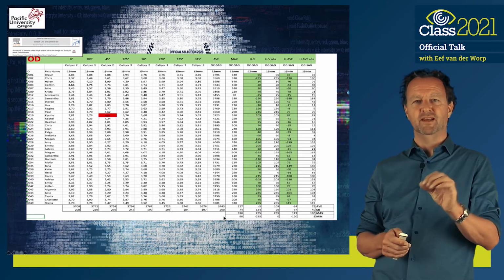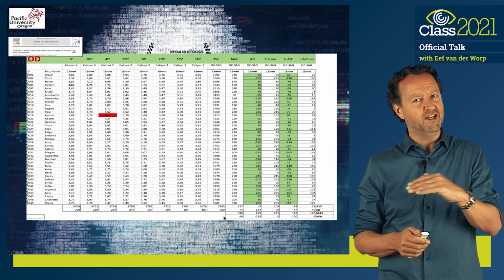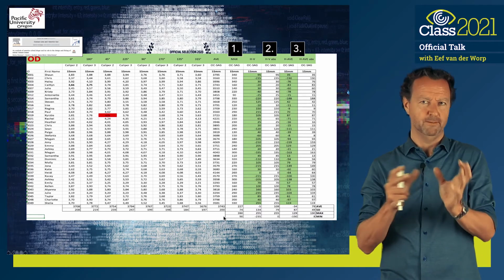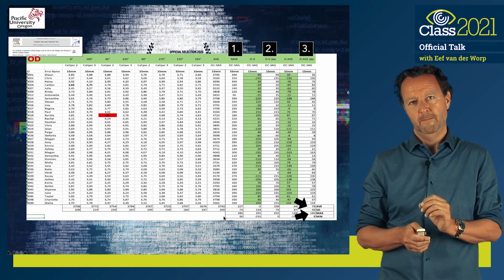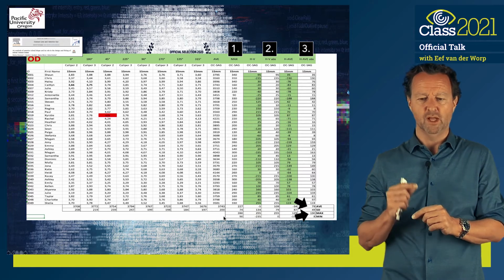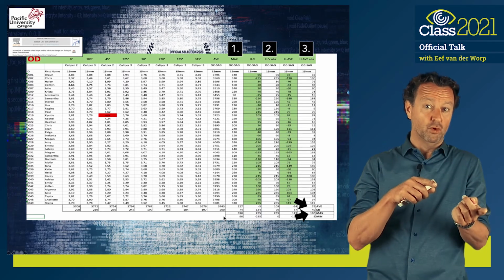But the trick is, as Alessandra told me, of course, she's right, you have to look at individual eyes and not at the averages. So let's try to do that, and I'll take a shortcut for you. I'll make it a little bit simpler how we got there. But basically, this is the number. There could be within an individual eye, on average, for individual eyes, about 79 micron difference, so about 80 micron difference, compared to the horizontal one.